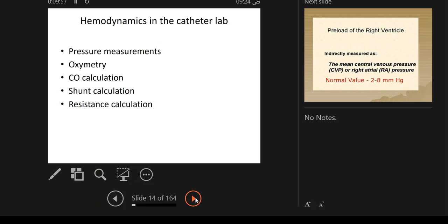Okay? We used to have a colorimetric oximeter in the Cath Lab, which had little plastic things. You fill it with the blood, and you just put it in, and from the color of the blood, it gives you the oxygen saturation immediately. That was much easier. I tried looking for one. They don't sell them anymore because, as you know, cardiac catheterization now is not as important a means of diagnosis in heart disease as it is an interventional thing.